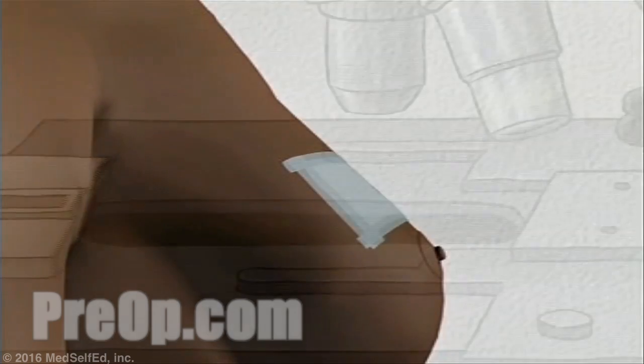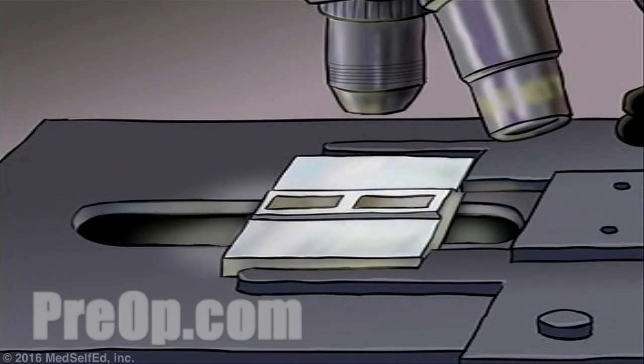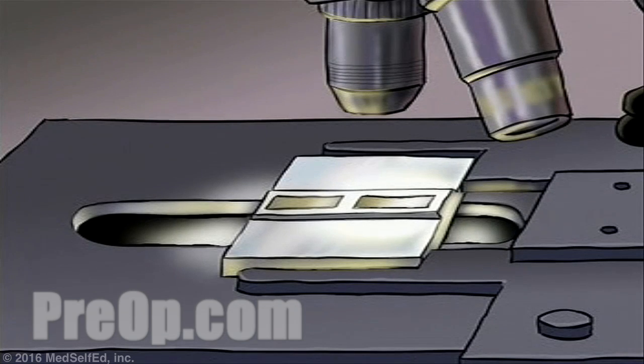Finally, a sterile dressing is applied. Your specimen will be sent immediately to a lab for microscopic analysis. Your doctor will tell you when to expect results from those tests.